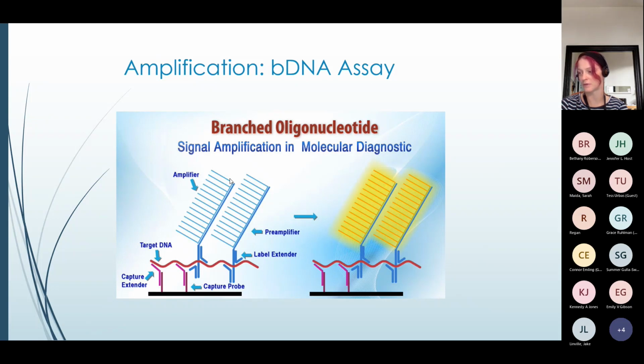This is a preamplifier. It's not necessarily amplifying your DNA, because your DNA is captured to the surface; it's actually amplifying the amplifier, so your signal is increased that way.